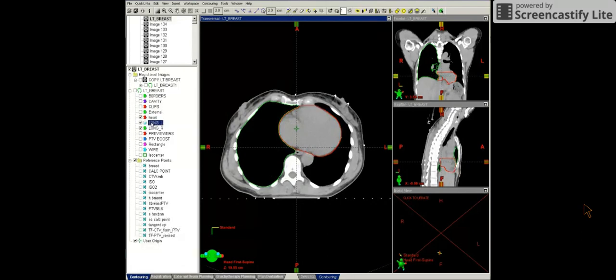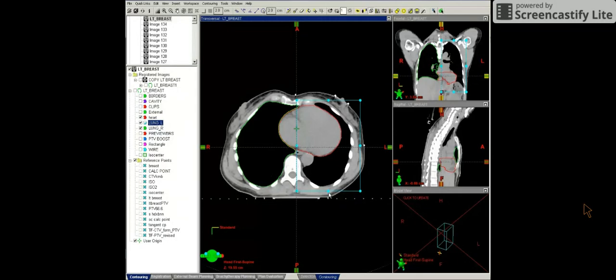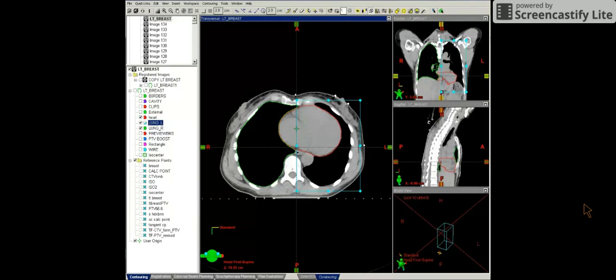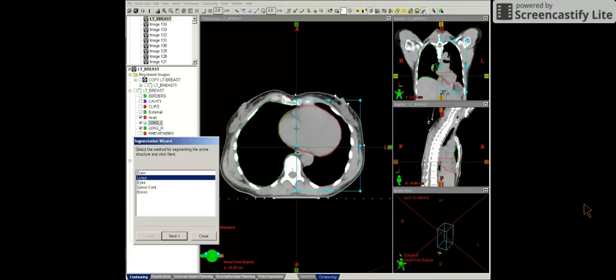And the other contours that we look at for 3D breast plan is the lung. So I'm going to show you how to contour the left lung here. I'm using the VOI bounding box. I'm making sure that it's just around the area of the lung that I want to use. So I'm checking the coronal view as well. I'm going to go to segmentation wizard. This is going to help automate the lung contour.